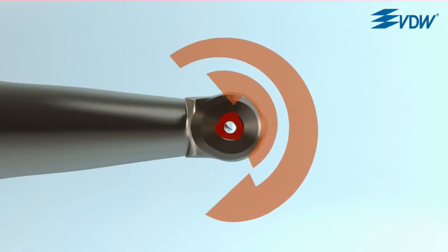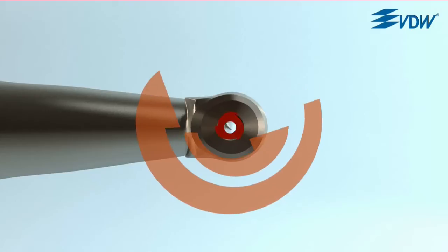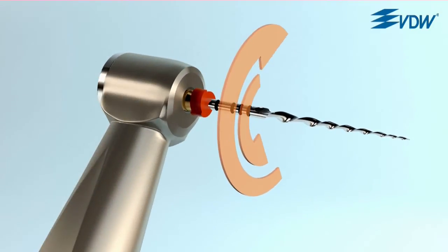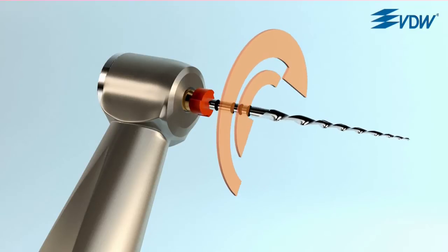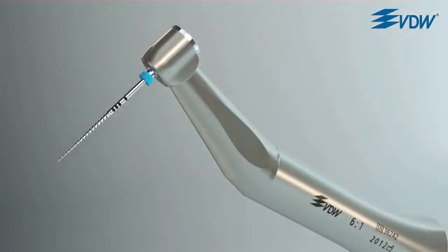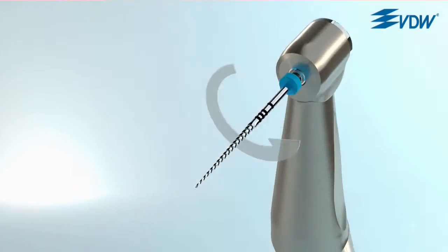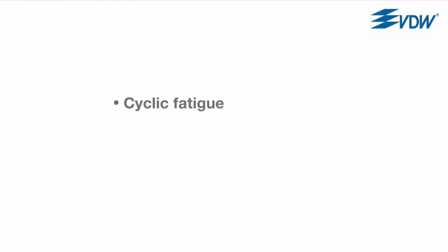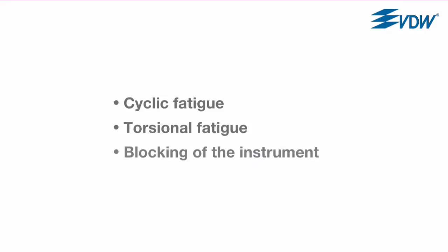The reciprocating movement is the way to avoid one of the most common risks during preparation – instrument fracture due to overstressing the material. In order to understand the advantages of the reciprocating movement, we need to take a look at the main reasons conventional rotary instruments fracture: cyclic fatigue, torsional fatigue, and blocking of the instrument in the canal.